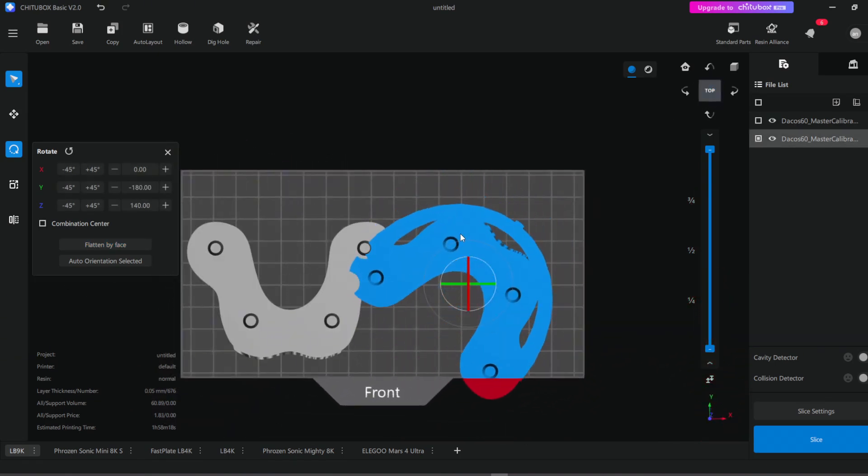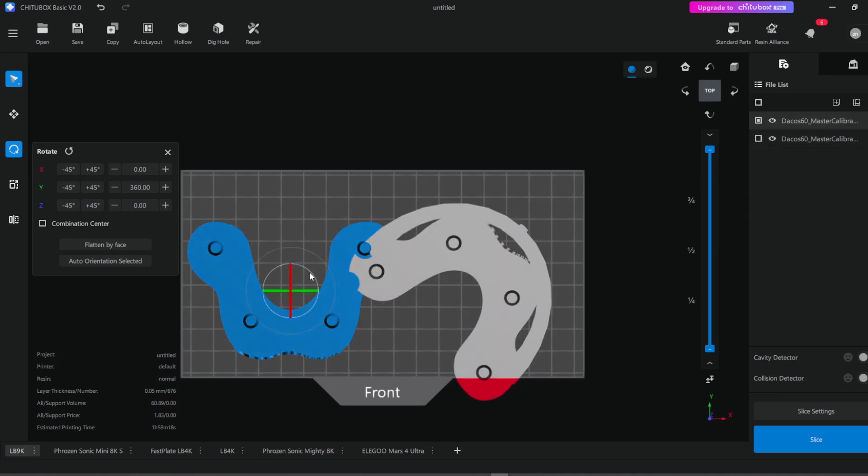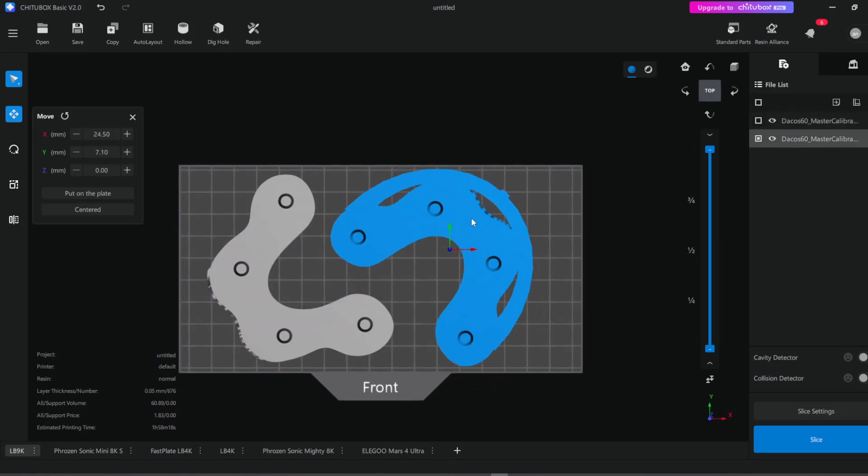Make sure to rotate the models so that the caps face the build plate, as shown here. This orientation will match how you'll print your dental models.